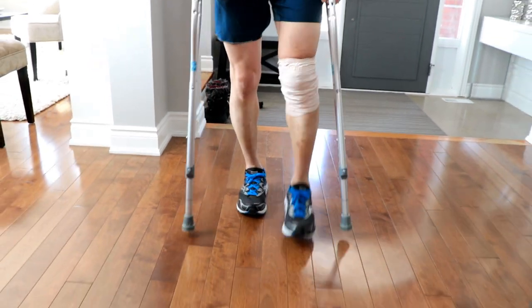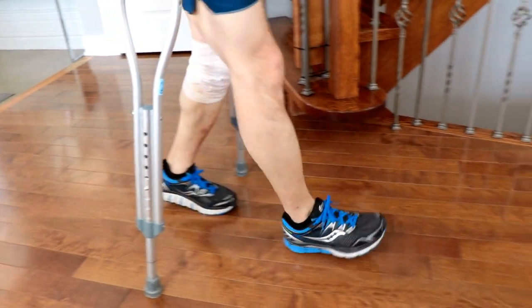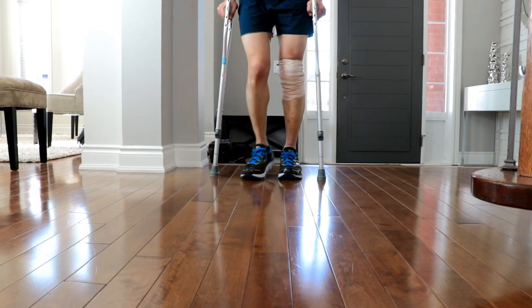All three points of contact move forward — both crutches and the injured leg. Then the strong side steps through. This cycle repeats itself.